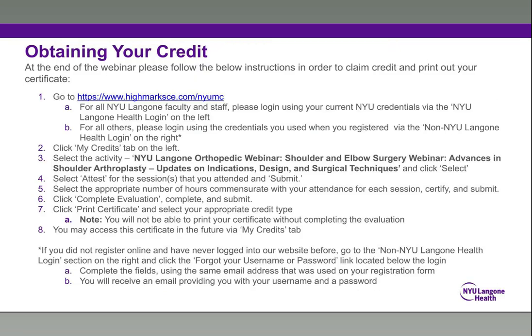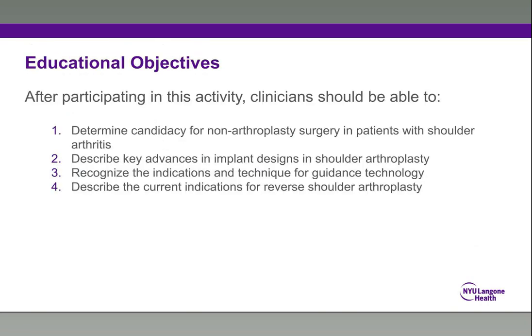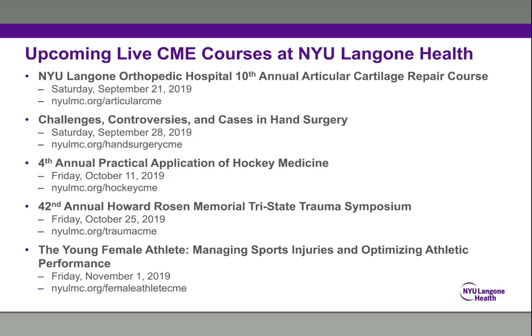And then finally, one of the biggest markets these days that I see among patients getting the reverses, or at least among some of these surgeons, is that surgeons who don't routinely do anatomic replacements do feel comfortable doing reverse replacements because they are either general surgeons or sports surgeons who are seeing older patients with rotator cuff that is no longer repairable, and they feel like they could put in a couple of reverses a year and still have a reasonable outcome.